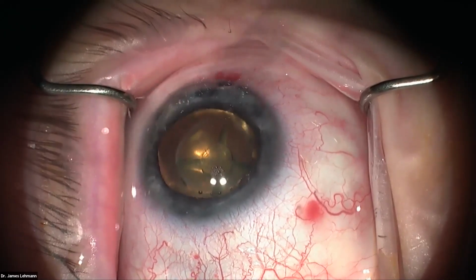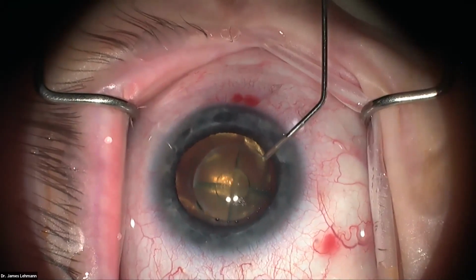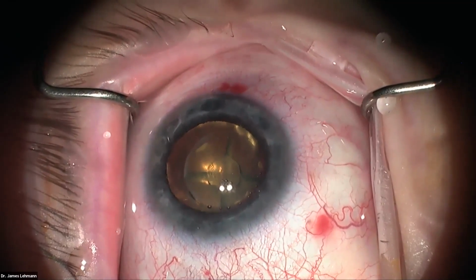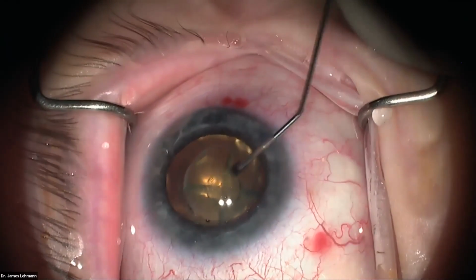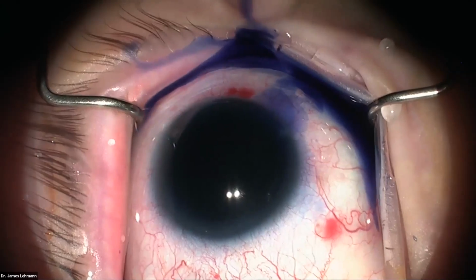This is some topical lidocaine, so it may sting a little, ma'am. So this is lidocaine with epinephrine to help maintain pupil dilation during the case. It's unpreserved. It goes by the name of Shugarcaine here in the US. I'm going to inject some VisionBlue so you guys can see the rhexis a little bit better, because you may not have such a detailed view through the stream.